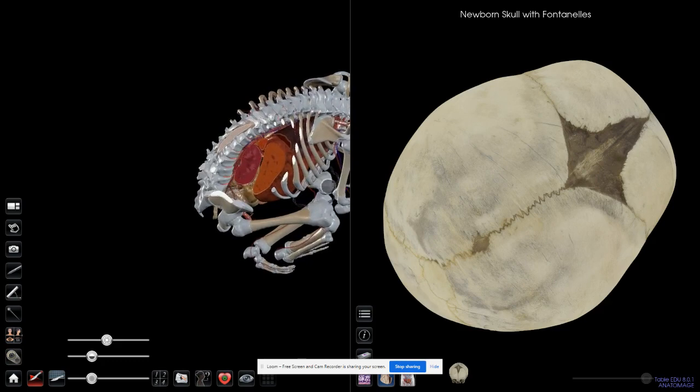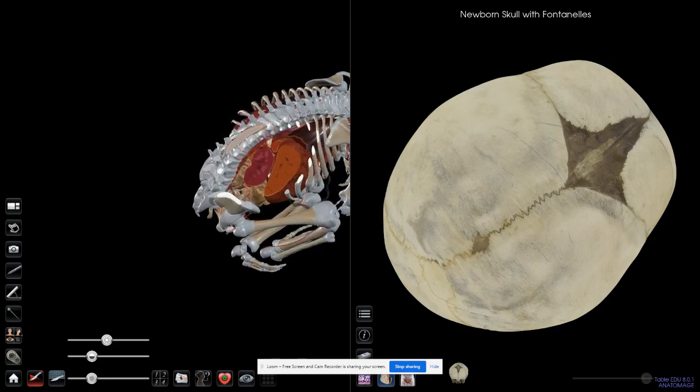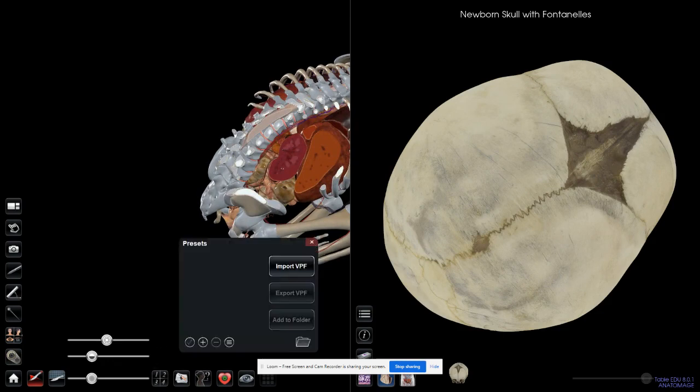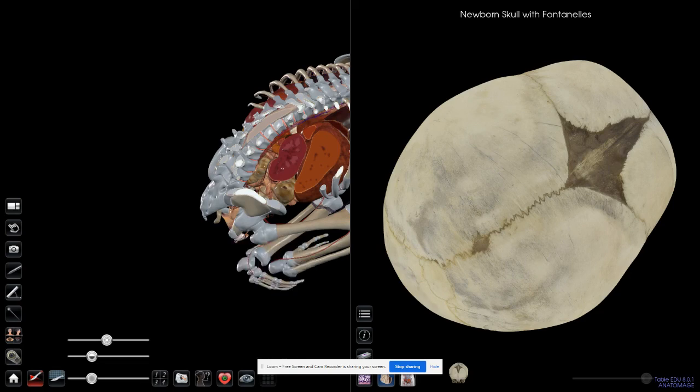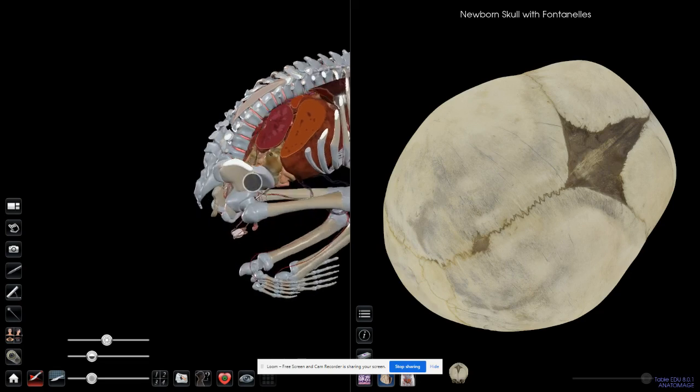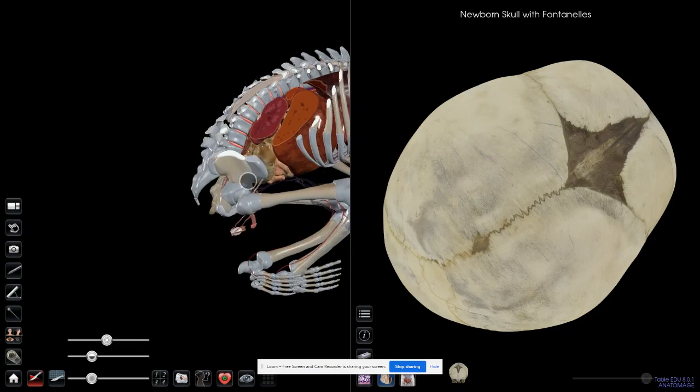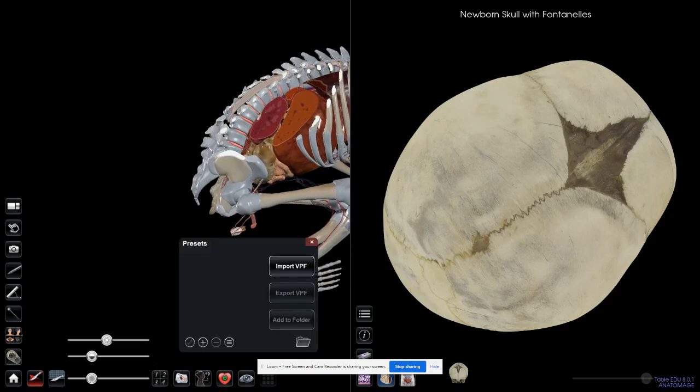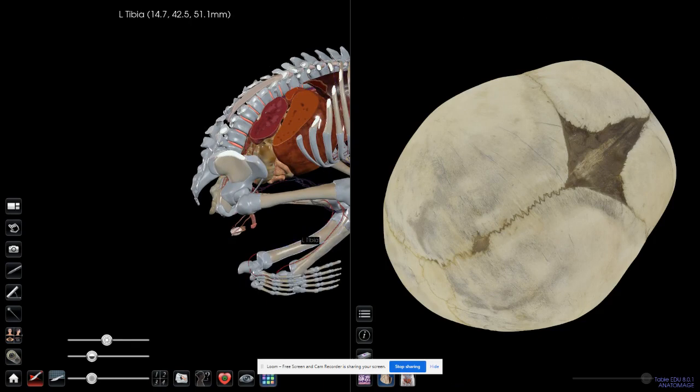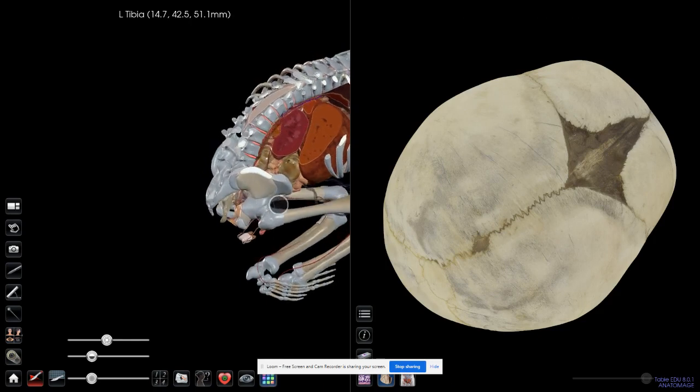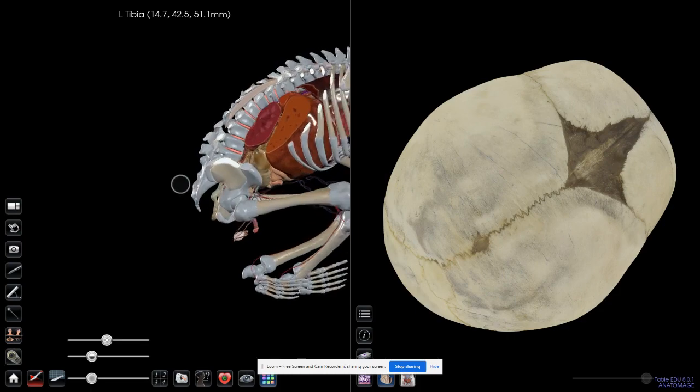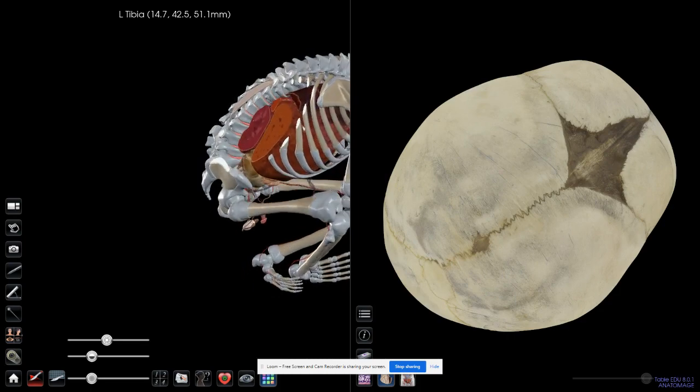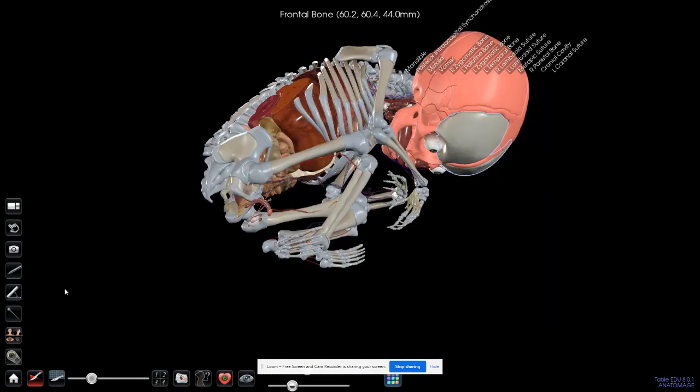Then comes this one, two, three, four, which is importing, saving it as later on after you have put your notes, your drawings, and you want to show it to your students, your peers. You can import and it would save as an Anatomage Table setting, not as a screenshot JPEG or PNG, so you cannot open it except with the Anatomage Table.